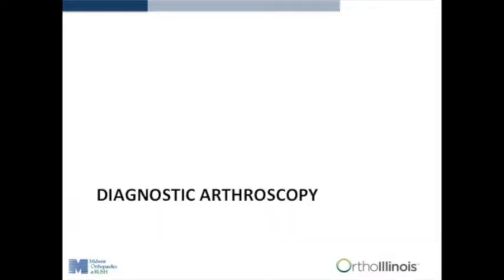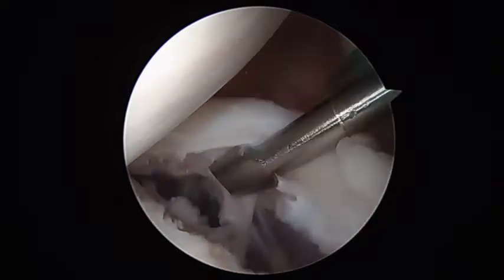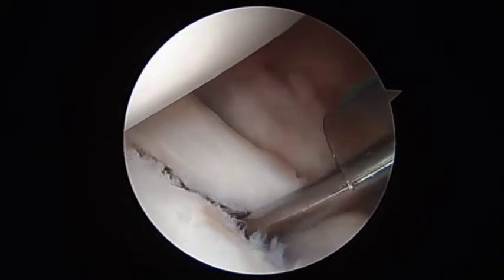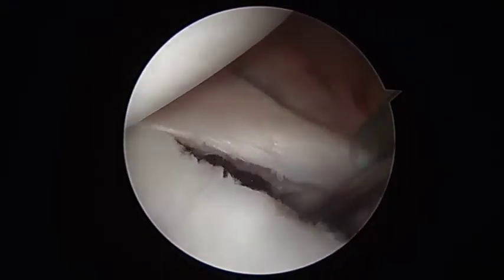The patient was taken to the operating room and placed in the lateral decubitus position using a traction arm holder. Examination under anesthesia was performed, revealing grade 3+ shift in the anterior superior, anterior middle, and anterior inferior directions under load. There was also a grade 1+ posterior translation with the load and shift test.